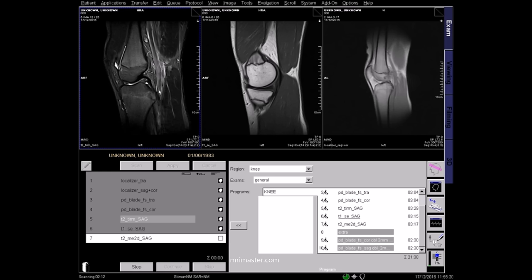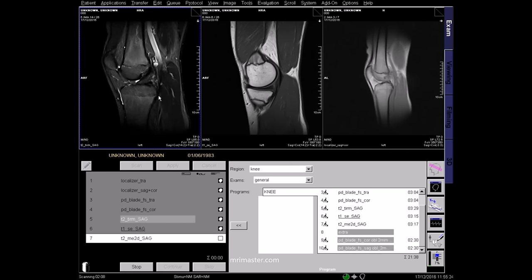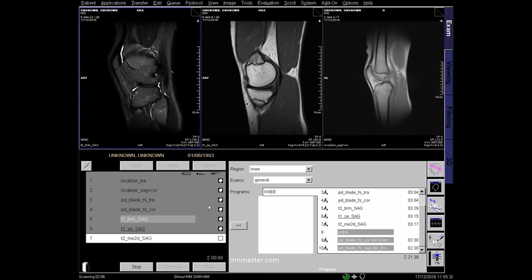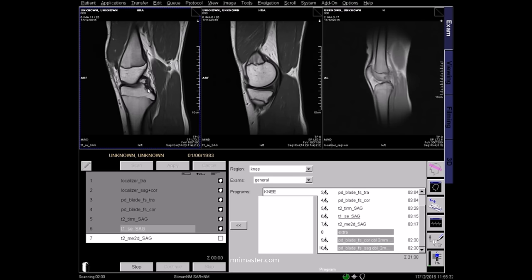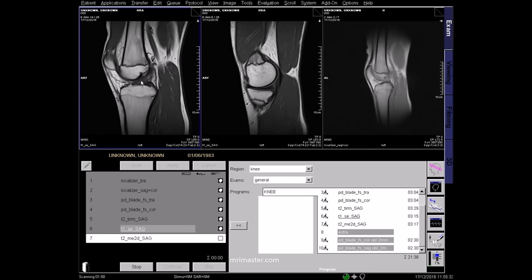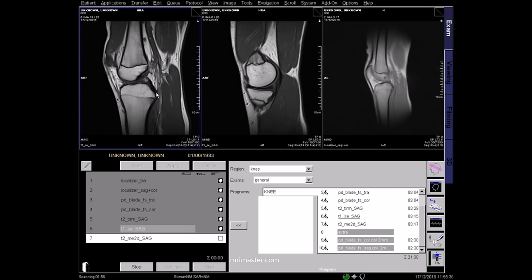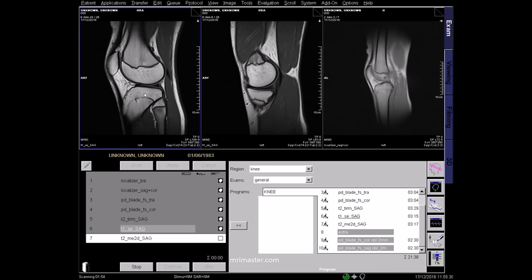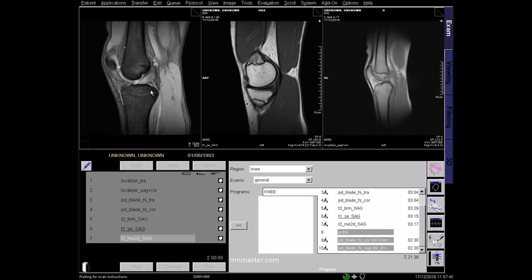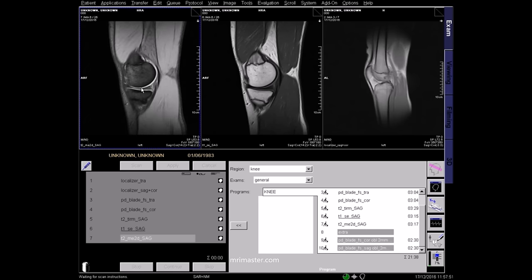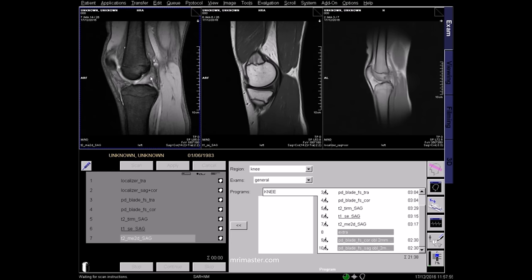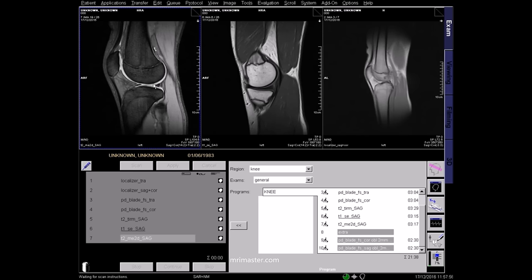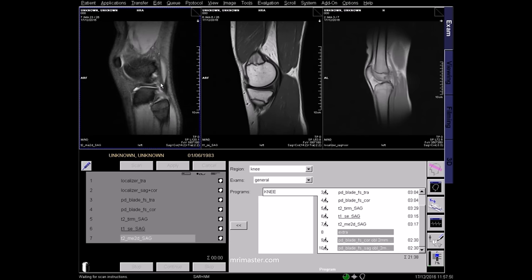This is a STIR sagittal image where fluids appear bright and fat appears dark; STIR sagittals are useful for highlighting infection and bony oedema. This is a T1 sagittal image where fluids appear dark and fat appears bright; T1 sagittal is useful in the diagnosis of cystic and blood components — blood would appear bright on T1 scans. This is a T2 star, or T2 gradient echo, sagittal. In this sequence fluids appear bright and muscles appear grey. T2 star sagittal is very useful for visualising the menisci and for assessing the ACL and the PCL.